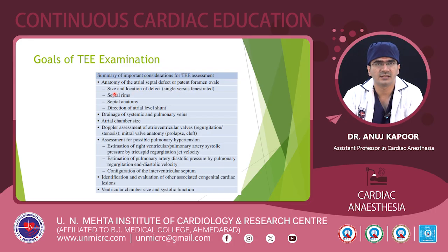We will have to ascertain the septal rims that we have discussed, what the sizes of the rims are, and especially in a case of device closure, we will assess the septal anatomy and also the direction of the flow. That will guide us on whether right to left shunting or left to right shunting is there. It will help us to assess the pulmonary flow and the systemic flow and the resistance.